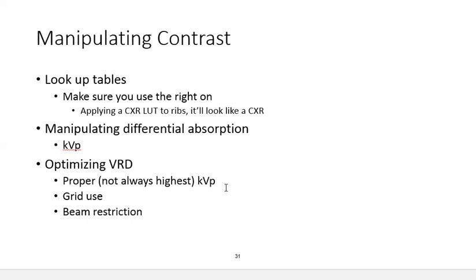And increasing the KVP only makes things worse. So if we're shooting through a tissue type that creates a lot of scatter, soft tissue, abdomen, really pretty much anything that's knee size or shoulder size or above, we need to use a grid because we create a lot of scatter radiation. So the purpose for a grid is to clean up scatter radiation after it's created.